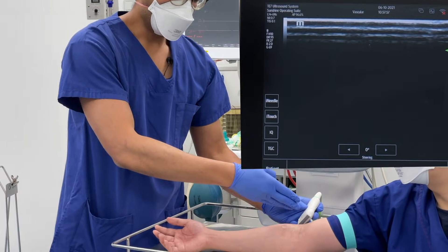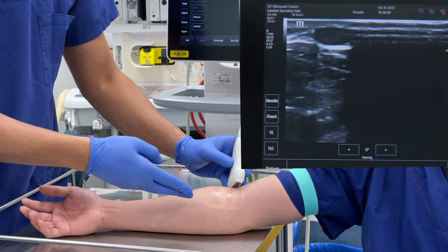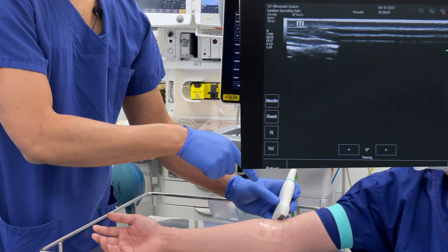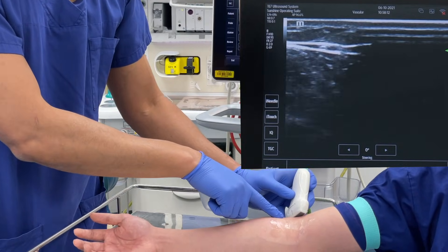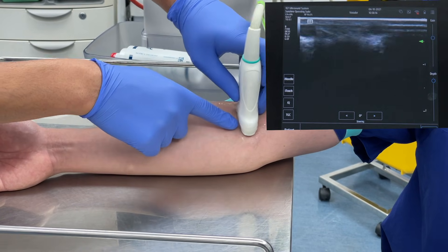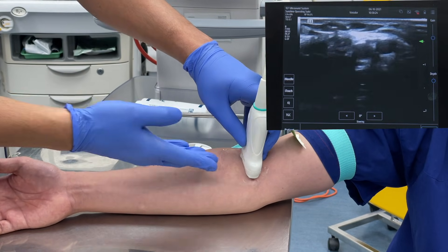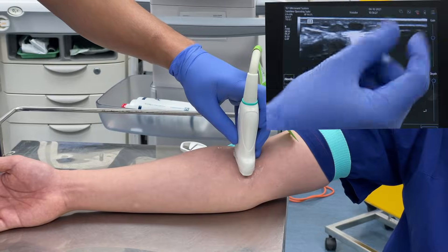Looking down here, the cephalic veins are generally on the lateral side and basilics are on the medial side. When starting out, I'd aim more for the lateral veins because they don't have as many critical structures like arteries and nerves underneath — so that's a safer choice. On the medial side you've got your basilic veins, but below those are a number of critical structures. I'd recommend the medial side only once you're more comfortable and familiar with needle depth.